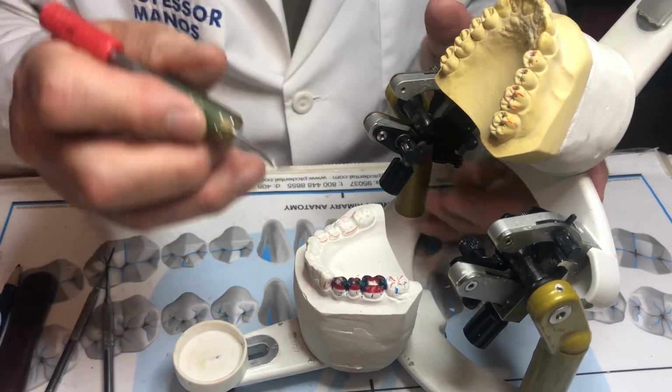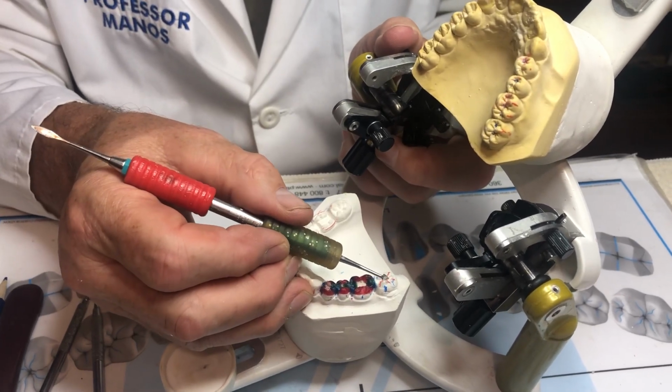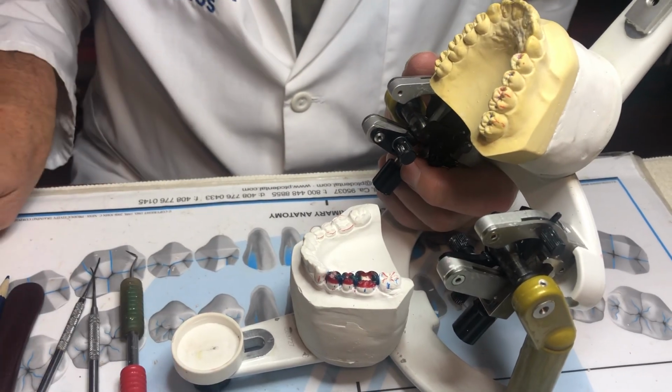Let's go over to the molar, the more difficult. I've already, from the last video, marked it in red so you can see the direction of the cusps. The contacts, let's take it in blue.